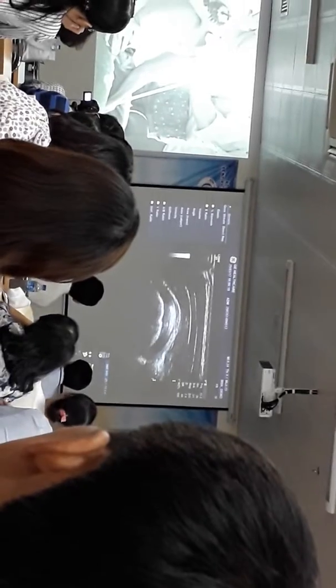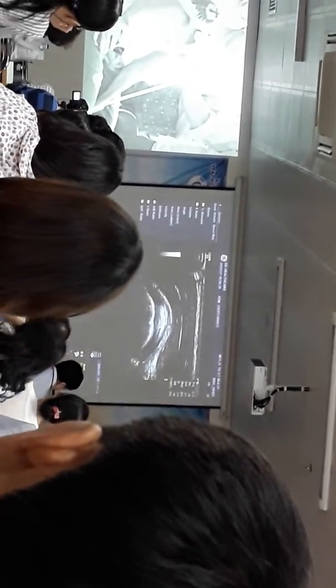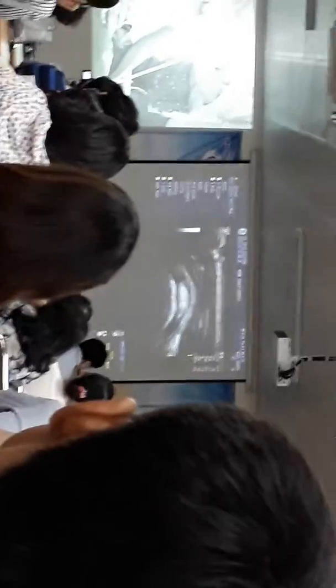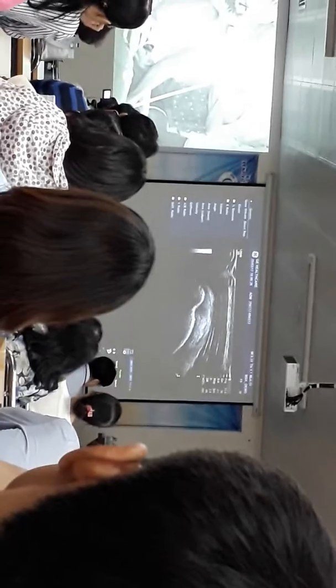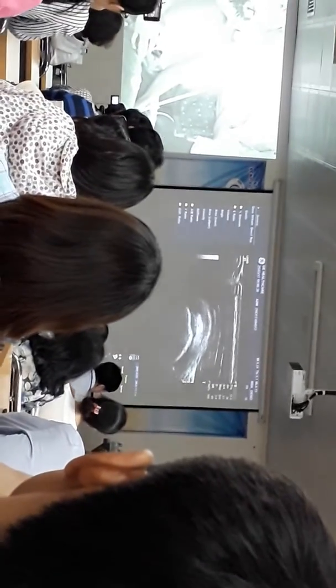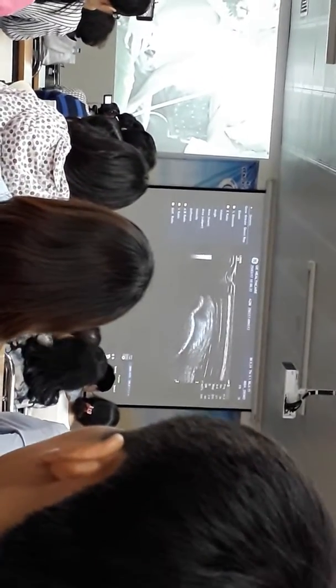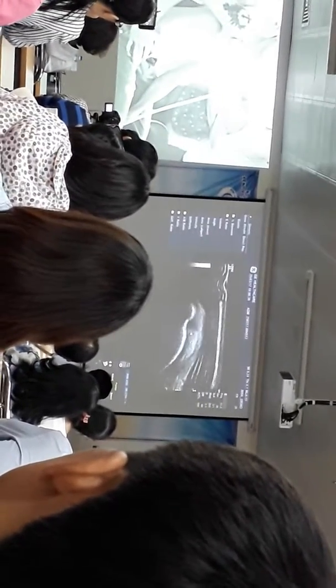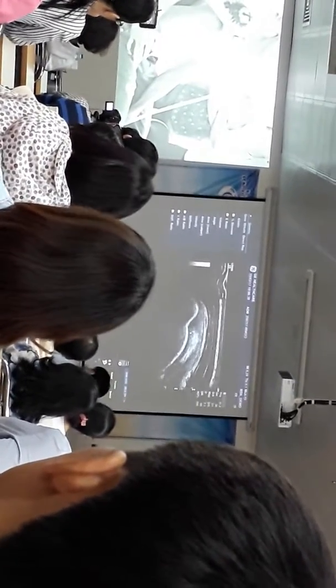So to start off, once again, we use our long head of biceps as the landmark to know what is supraspinatus and what is subscapularis. So anything more posterior from that point there is going to be supraspinatus tendon.